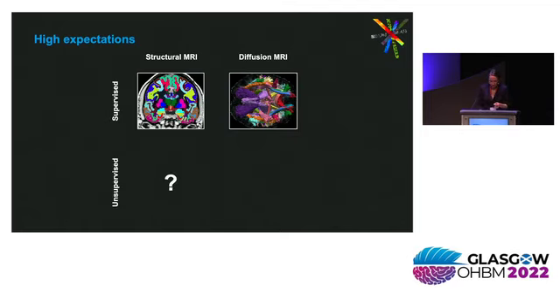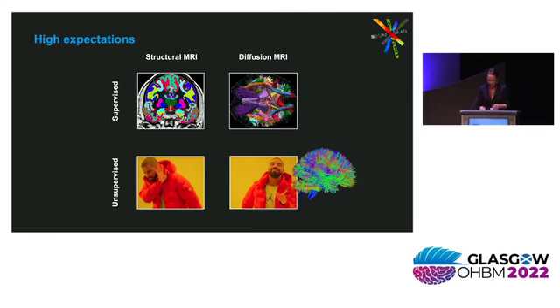What would it be like to use a structural segmentation algorithm in unsupervised mode? So we don't know what structures are there in the gray matter. The algorithm segments the gray matter. It gives us a new nucleus that has never been documented before. We give it a new name, the nucleus of Glasgow, and we publish it. We typically wouldn't do that with structural data, but we do that sometimes with diffusion data. And that's when we run tractography in unsupervised mode.